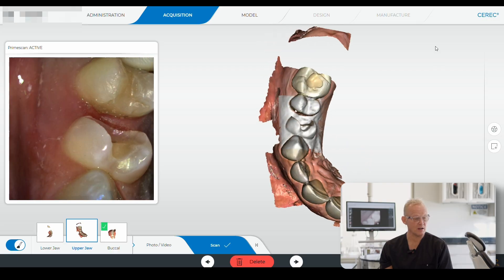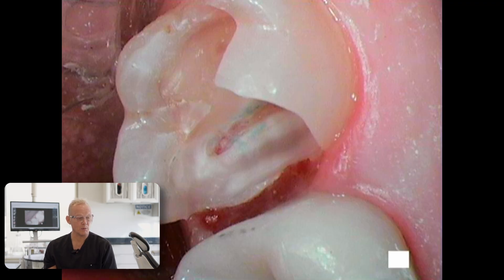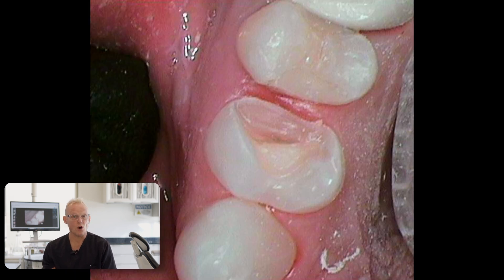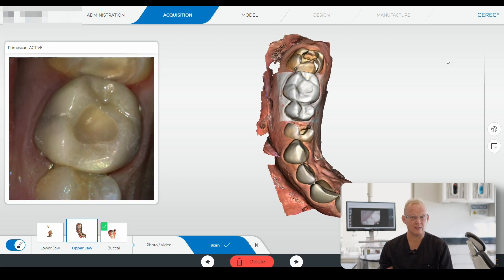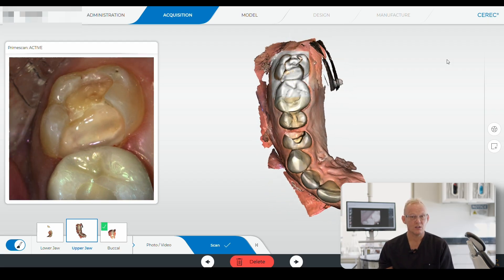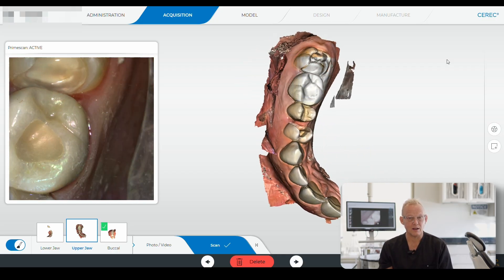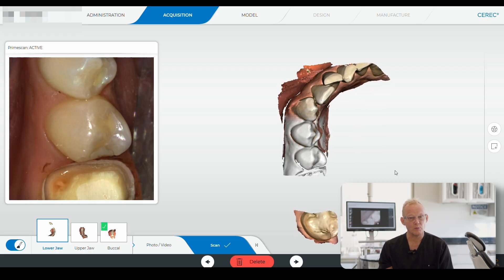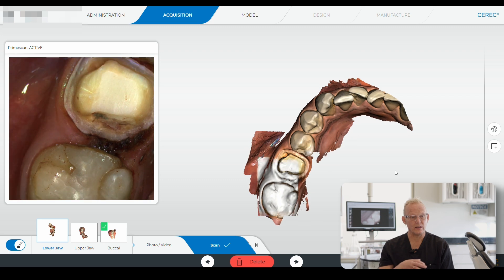These videos show me scanning the tooth structure after preparation of both teeth. I removed the decay, which was very close to the pulp or where the nerve is, but we did not penetrate into the nerve. We use ozone in our office — it reduces inflammation, kills bacteria, and can rejuvenate the pulp — preventing a root canal in the future. Then we verified all the decay was gone before doing the scans.